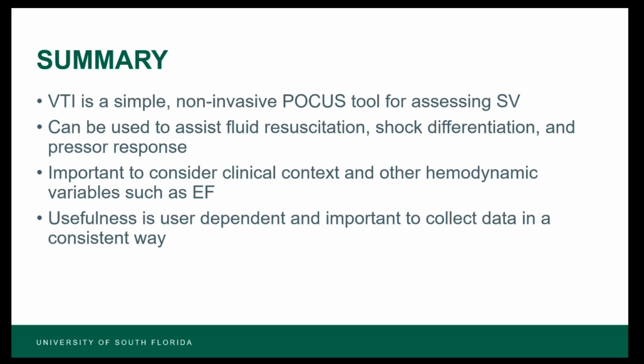So really, at the end of the day, your VTI is very useful in very sick patients, like we mentioned before, in guiding clinical decision making, but it's also very user dependent. So you have to collect this data very consistently, going through your ultrasound in a very methodical way so you're obtaining reliable information, and obtain serial VTI numbers so you're getting reliable information in the context of your patient, not necessarily in grand studies, because that would require a more in-depth level of data collection. But that is our presentation on VTI and how to best use it in the context of clinical patients and how to best guide your clinical decision making.